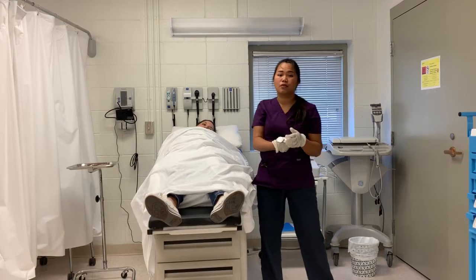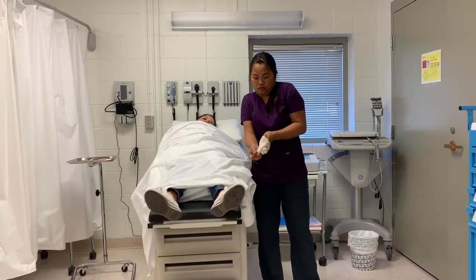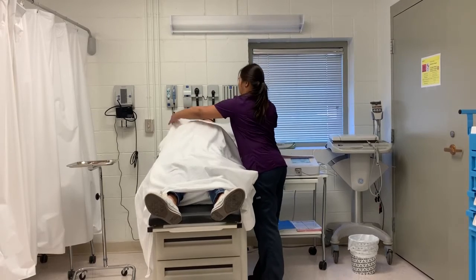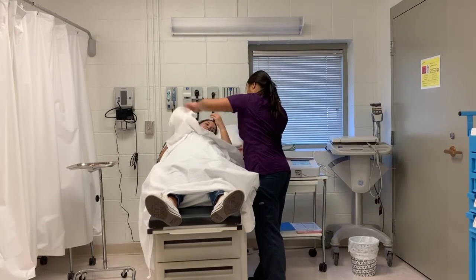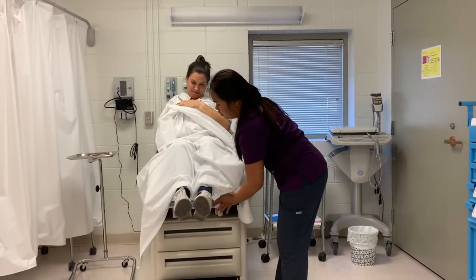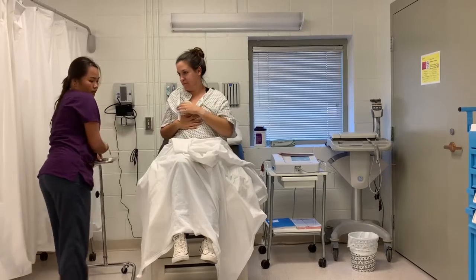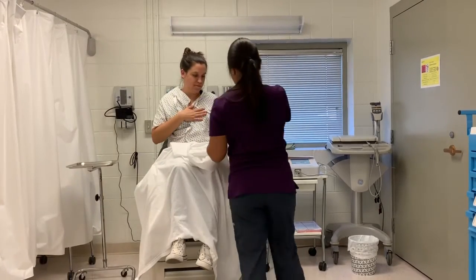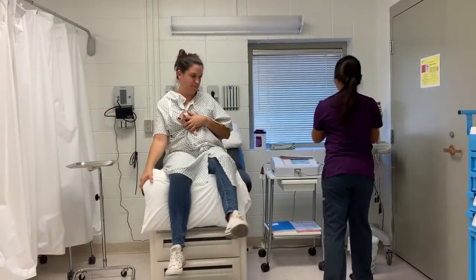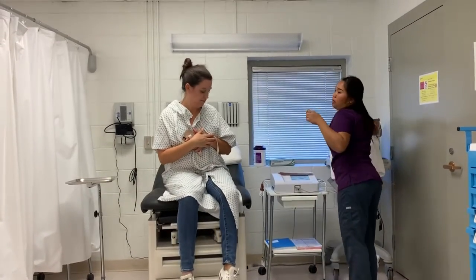I've counted all the electrodes. I have 10. I'm going to go ahead and help my patient out. Are you okay? Yes. Okay, let me help you out. Alright, so I'm going to give you all your belongings. The changing room will be at the same place, and I'll wait for you here.